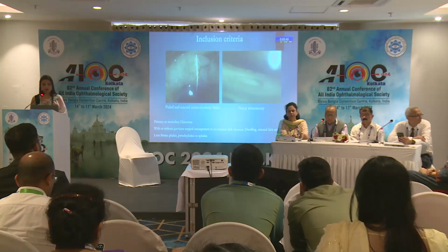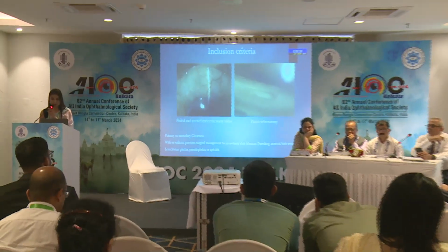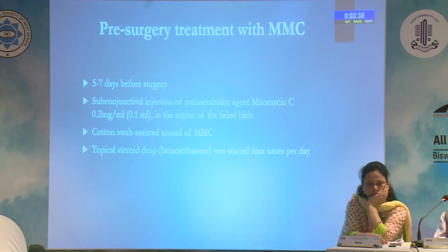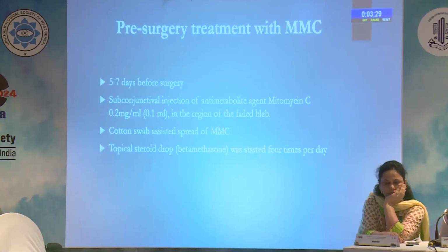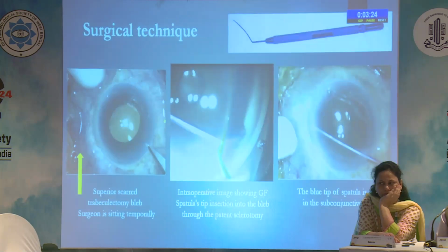Patients with a failed and scarred trabeculectomy bleb with a patent sclerostomy were included in the study. In all patients, pre-surgical treatment with MMC was done 5 to 7 days prior to surgery. It was an OPD-based procedure. Subconjunctival injection of MMC, 20 microgram, was given in the region of the failed trabeculectomy bleb, and we also started a topical steroid drop. This is the surgical technique.